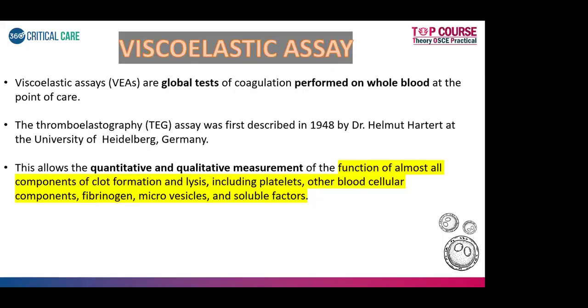They take 2 to 3 ml, sir, in a plain tube. For viscoelastic, the cup usually cannot take so much. It's very minute, I think. Some other person told 0.3 ml, sir. Yeah, 0.3 ml. Okay, it's a very minute thing. So it's a very minimal sample.